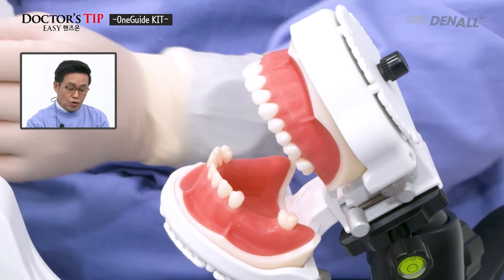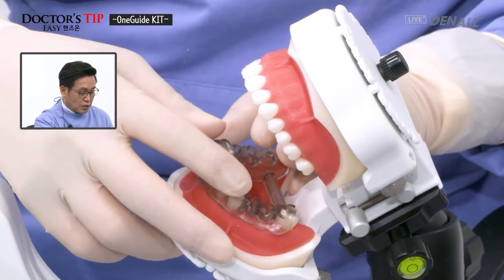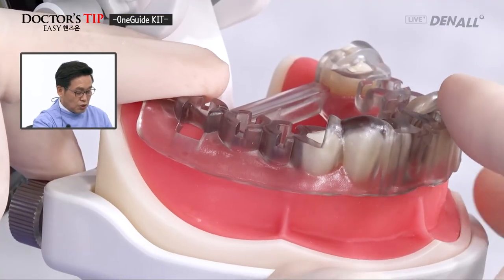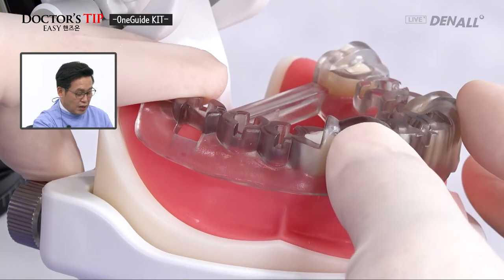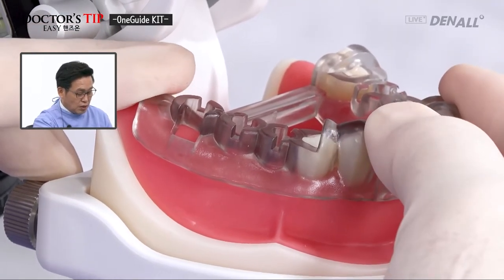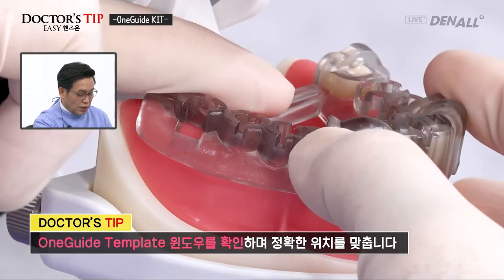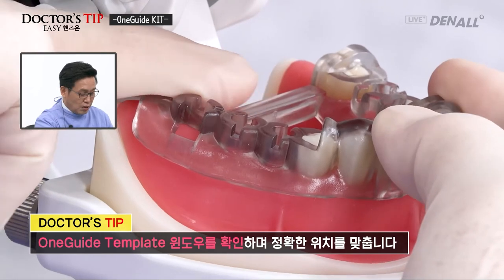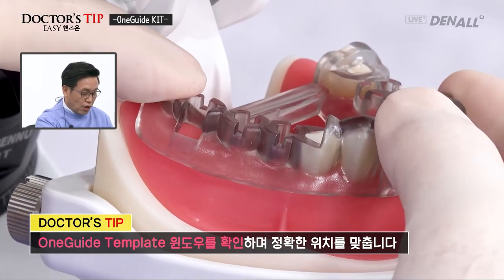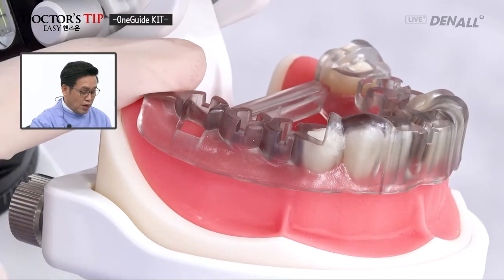First, we are going to use the OneGuide template that has been prepared, and I'm going to put it on the model. After you do this, as shown, if it is tooth bearing, if you get support from the adjacent teeth, you need to check the window between teeth so that the position is accurate. You need to be very accurate, and you check the template once again to proceed with the procedure.